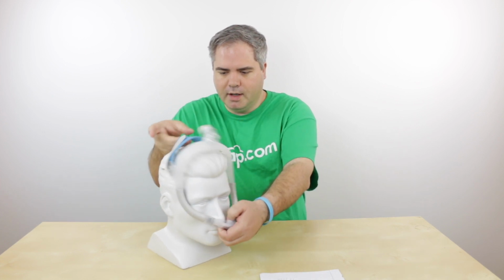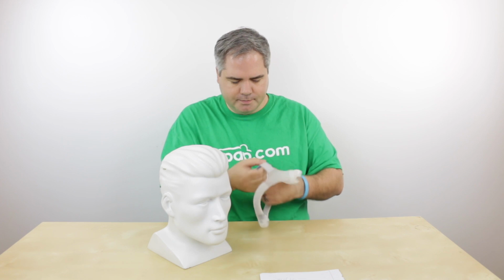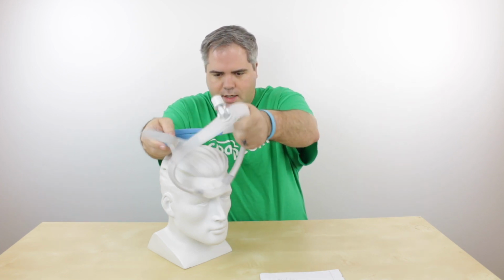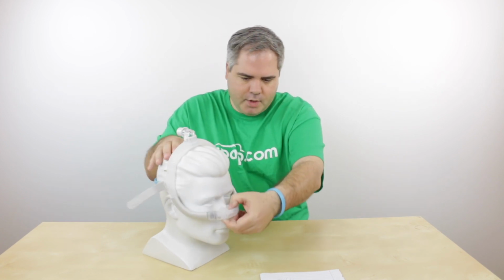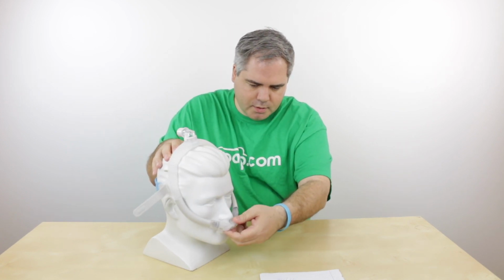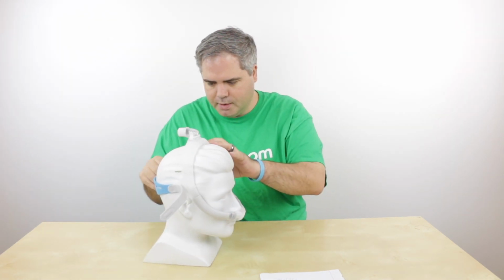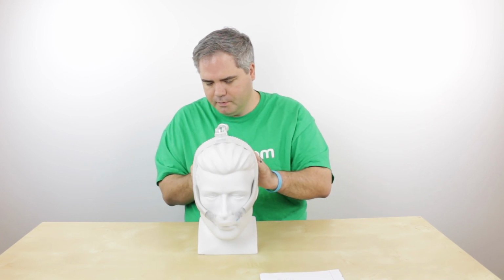For ease of use, we gave this an 8 because really all you have to do to put it on is just loosen the headgear straps, and then you'll just slide the mask over the back of the head like that. Make sure you position the pillows underneath the nose, and then you're just going to gently tighten the headgear straps here. Really, that's all there is to it. Very easy to put on.